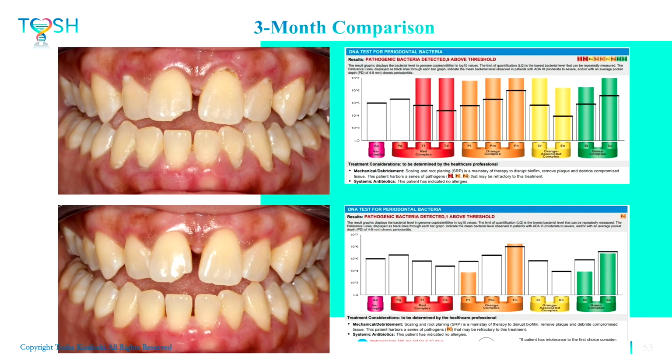So for her, we took another photo. I love intraoral photography, especially a retracted photo, because it shows that patient so much more. Patients are used to seeing their teeth and smiles, but not everyone has a gummy smile, so they don't always see what it actually looks like when you take retractors and pull their lips back. We also took a follow-up test. The benefit of taking a follow-up test and a before test is you objectively know if you decreased the overall pathogen load. So you can compare.